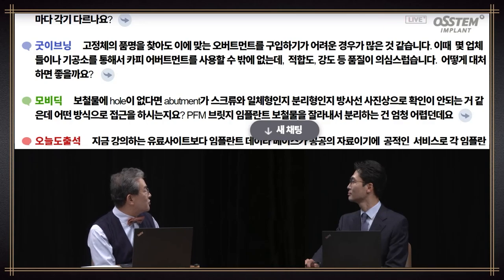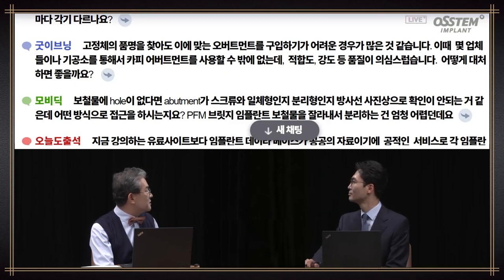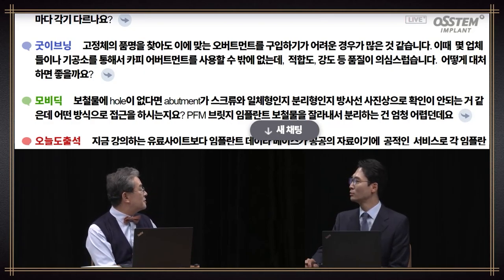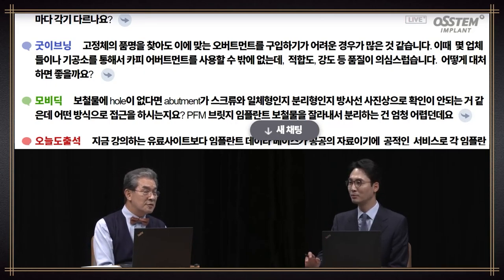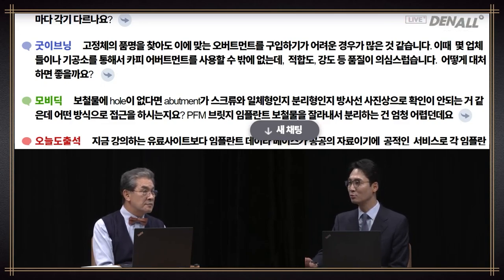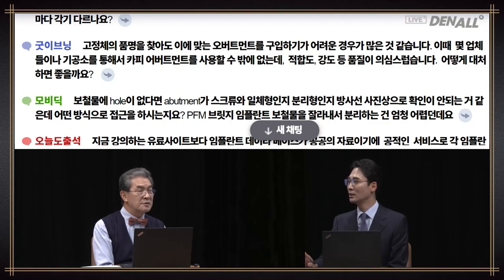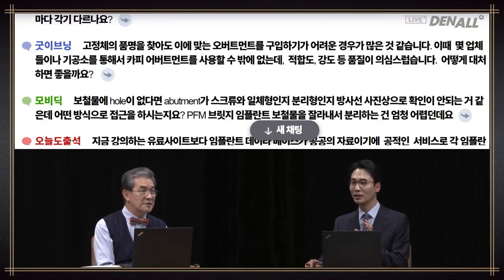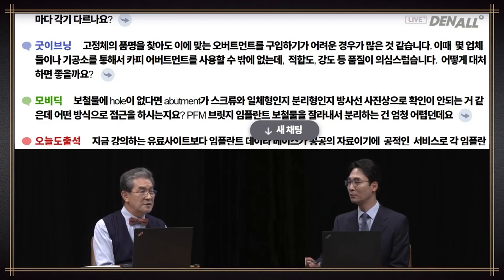If there is no hole on the prosthesis on the X-ray image, it is difficult to discern whether it is a one-piece or two-piece abutment screw. If it looks like cementation type in the oral cavity, it is difficult to determine whether it is one piece or two piece type. But if you take a periapical image properly, you can look at the standard X-ray image and discern — if it is one piece, there is no gap between abutment and abutment screw; if it is two piece, there is a radiolucent line. If you take a high quality X-ray image, you can identify whether it is one piece or two piece implant.